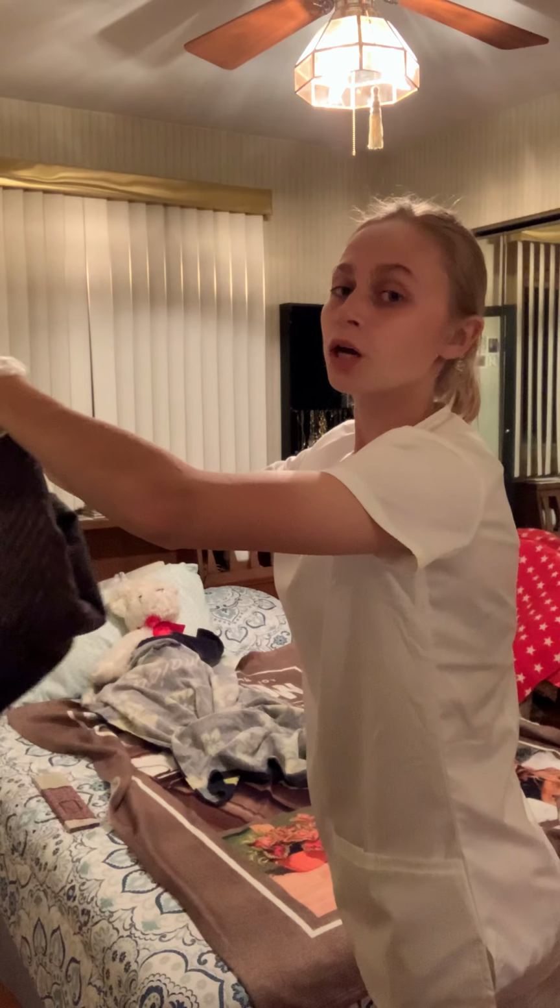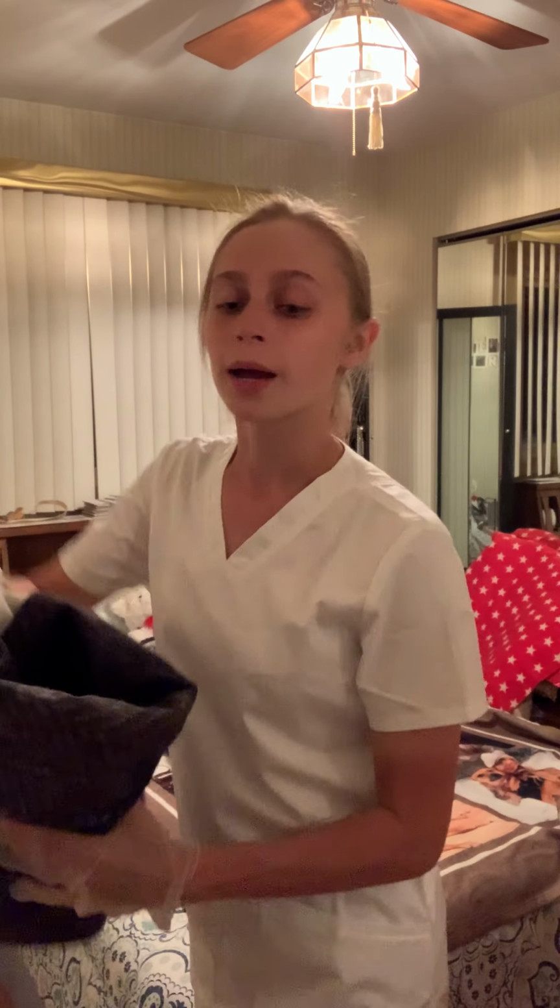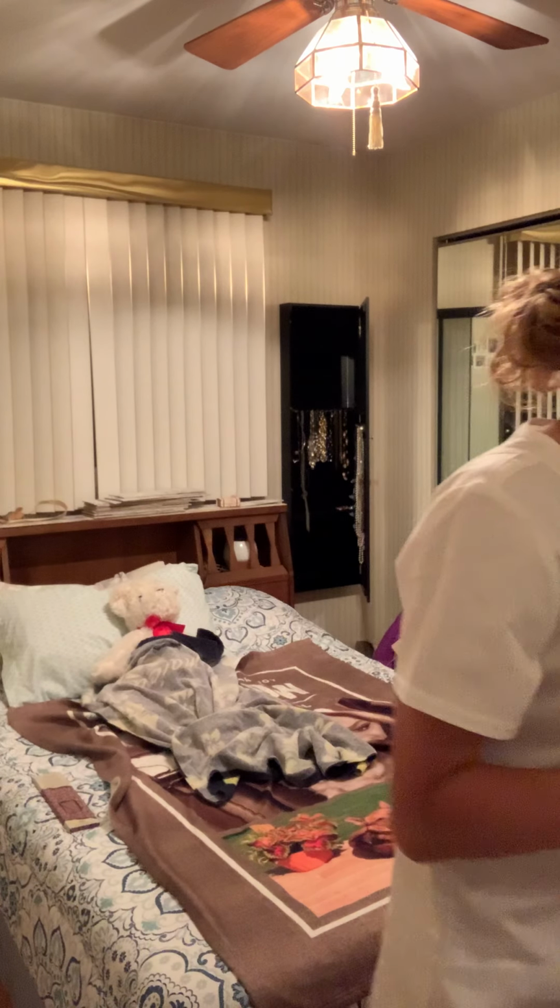This isn't soiled linen, so I don't need to dispose of it, but I should discard it in the laundry bag that I did bring with my supplies. So I'm going to be putting it in the laundry bag.